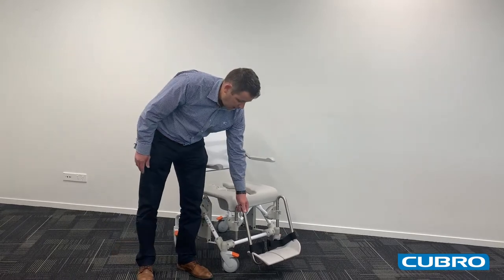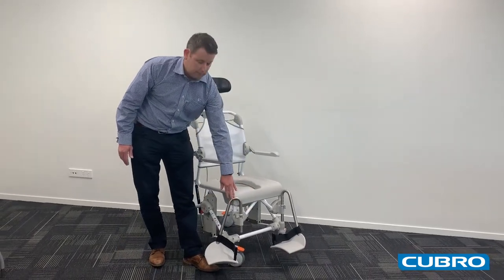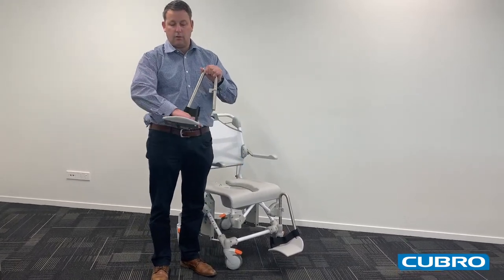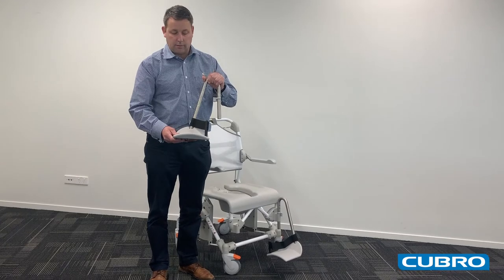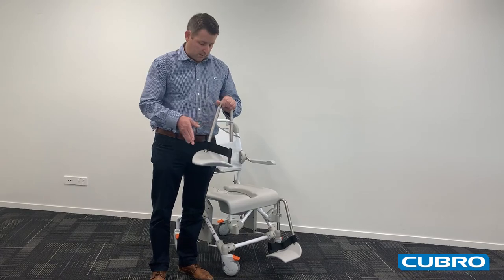The footrests are height adjustable and can swing away for access to the chair. They have a unique curved shape to meet the shape of the patient's foot, as well as providing support at the heel.